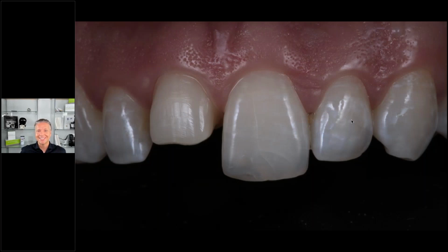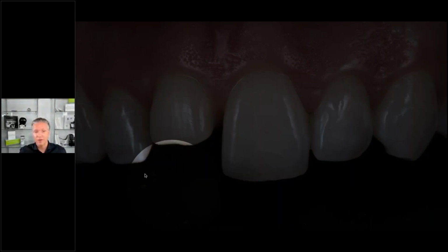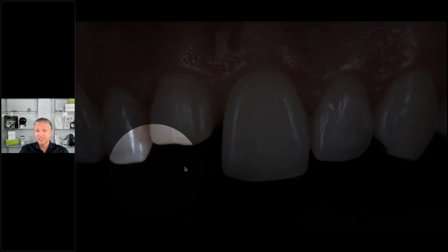When the doctor calls you, "Hey, I'm sending you a veneer, and by the way, it's going to be tricky, just check it out." And the model comes, or the scan comes in, and you see this, you say, oh. So now you can say, what's the problem? Just do a veneer, right? The problem is the area between the incisal of that prep and the actual incisal of our veneer that we would like to have, which is down here. So this whole black hole here is just air.